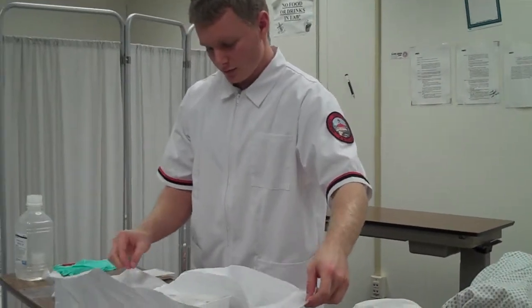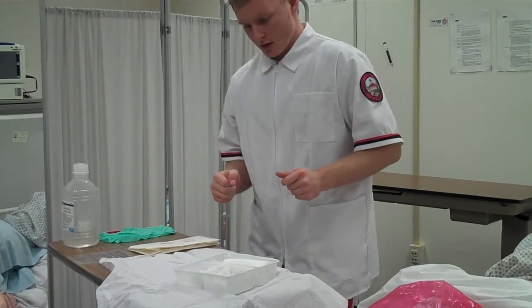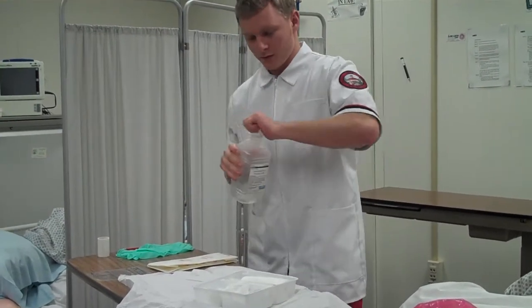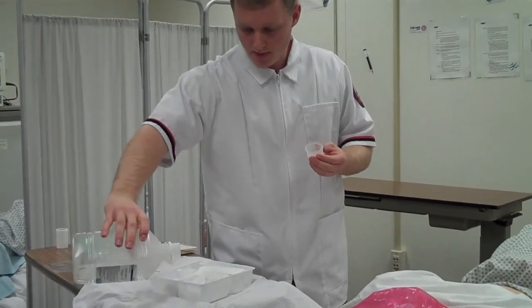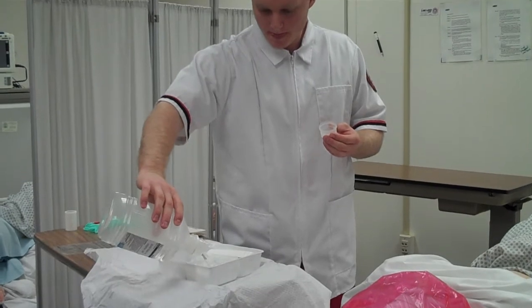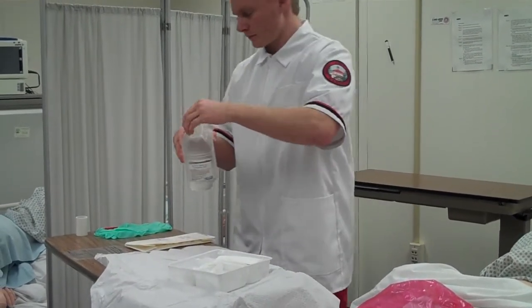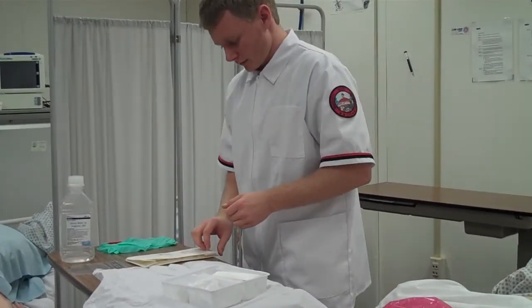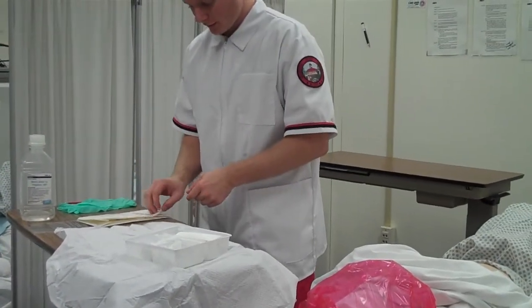I'm going to open it out away from me, the sides, and then do the back first. I'm going to pour my solution on my gauze. Now I'm going to have an inch border around my sterile field that's not sterile.